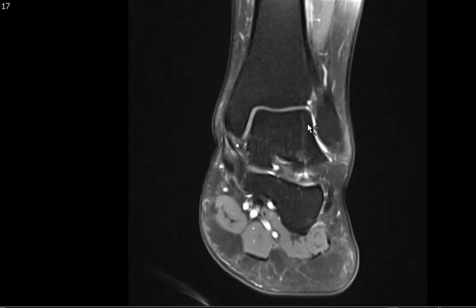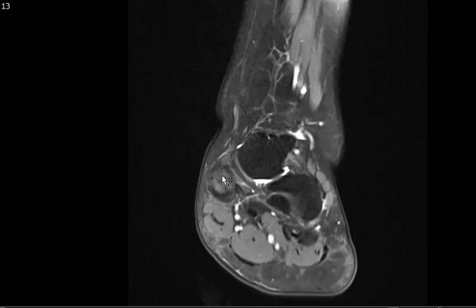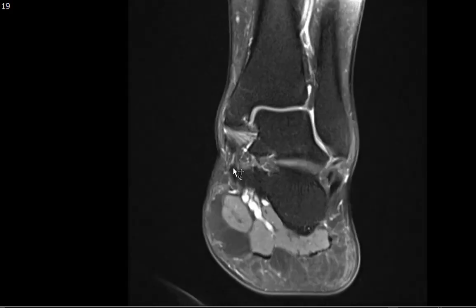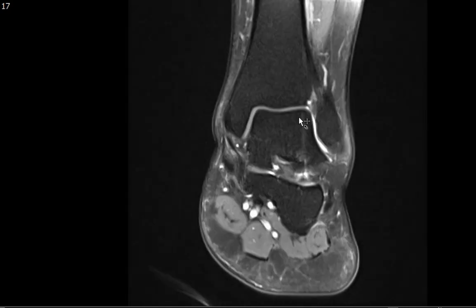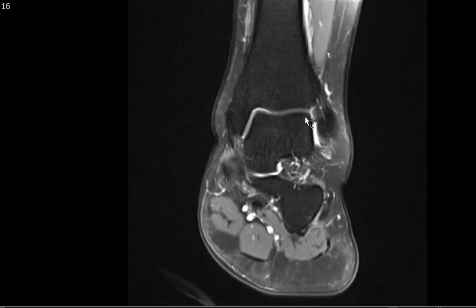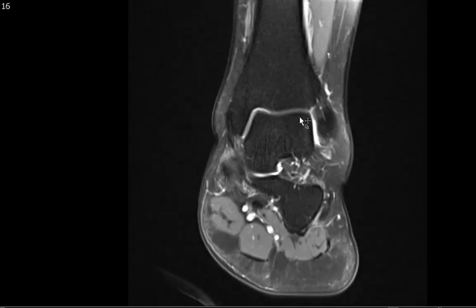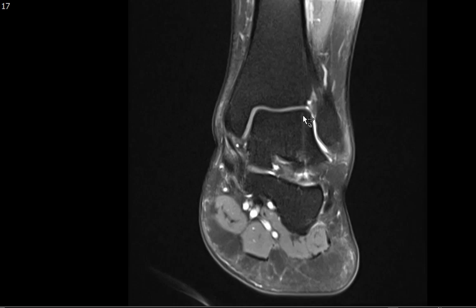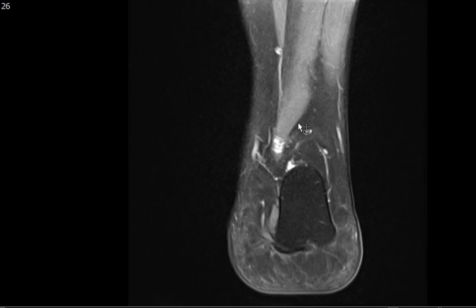On the coronal images, we look for significant marrow edema and also evaluate for osteochondral injuries or osteochondral defects along the talar dome, which is a common place for such injuries. We see none here along the medial or lateral talar dome. An osteochondral defect is a defect or injury to the underlying bone and cartilage. We don't see any of that here.